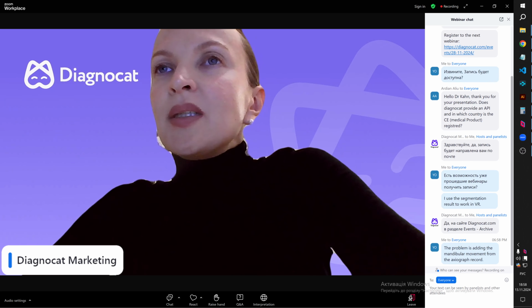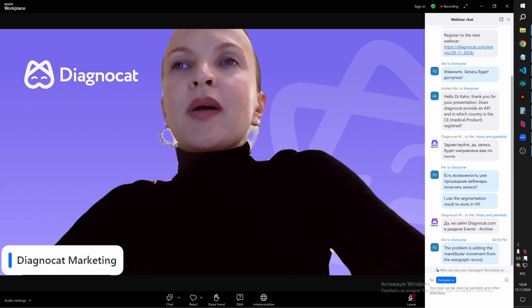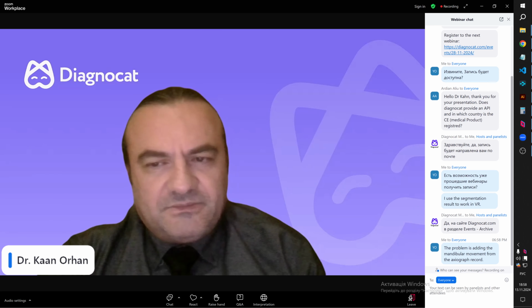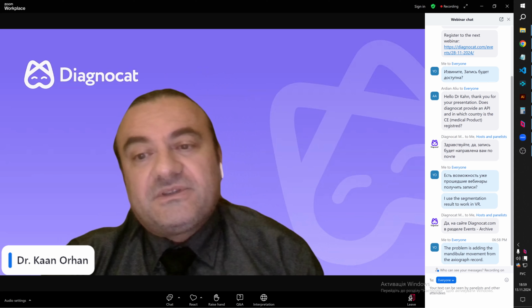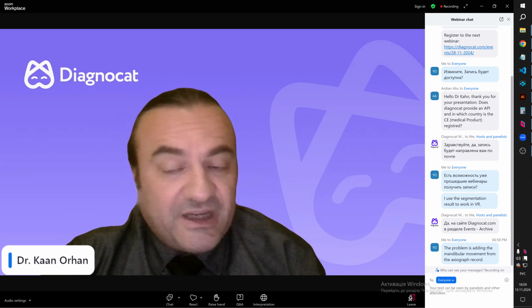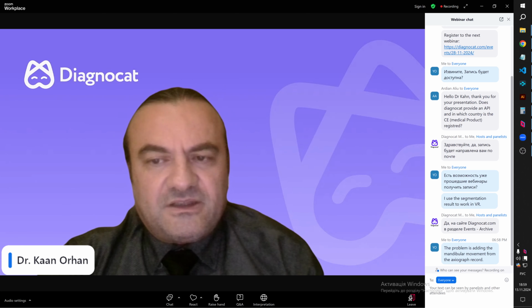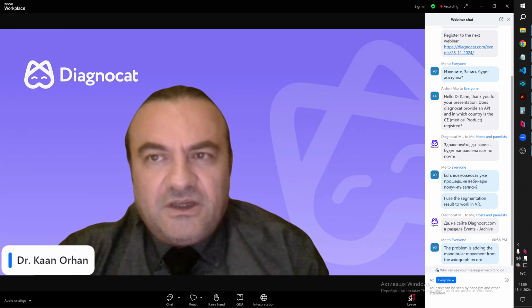The question is about adding mandibular movement from the axiograph record. I didn't get the question exactly, but perhaps he would like to ask about dynamic TMJ movement, with a technique like the axiograph record.